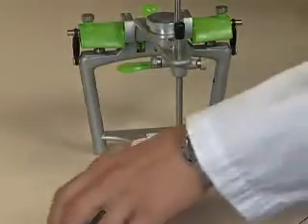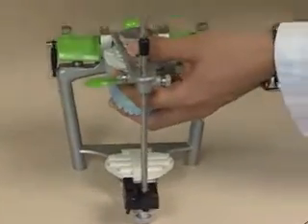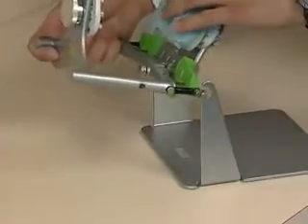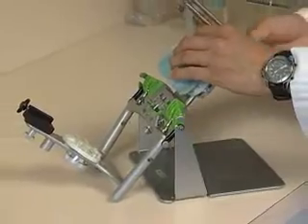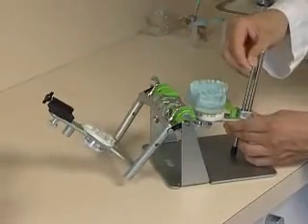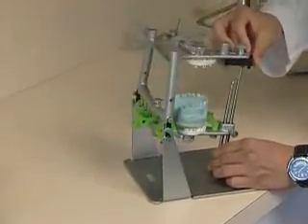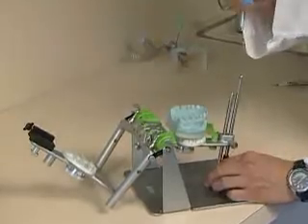We'll put the upper model back on. And we'll put the articulator into the mounting stand. And the top of the articulator will fit over the plate of the mounting stand. Elongate the posterior pin to stabilize the articulator. And now we'll determine the final length of the anterior pin when we put our wax bites on and our lower model, because we want the base of the lower model to be parallel to the floor.